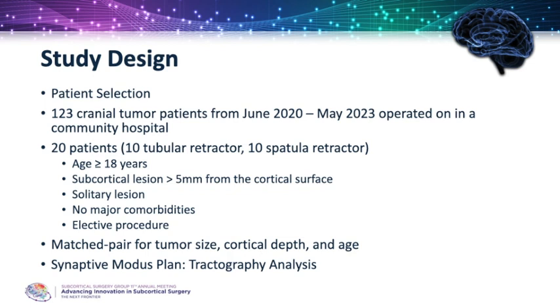We then paired these to a group of spatula retraction tumor patients, postoperative patients, based on the tumor size, normalizing for tumor size, cortical depth, as well as the age. And our tractography software being used in this case was a Synaptive Modus Plan.